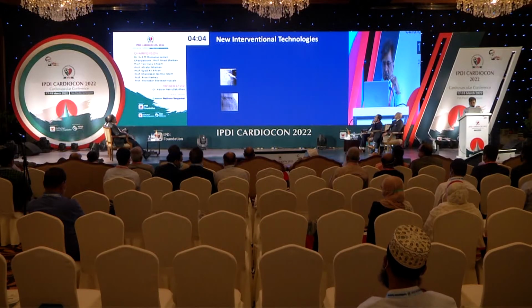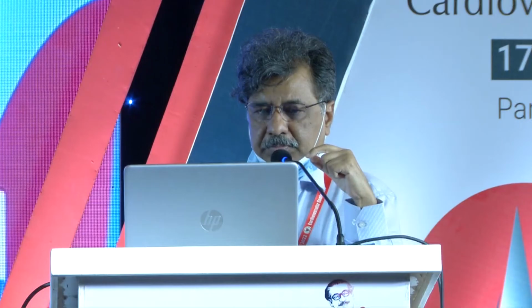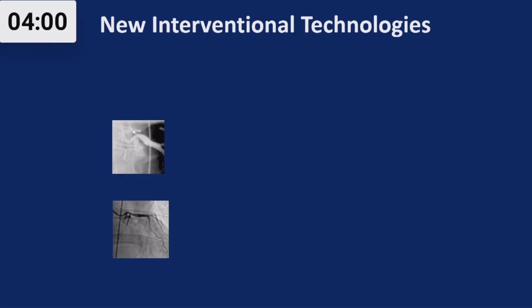And so that's why everyone says that IVUS is essential for left main PCI. I will show you one case report presented by Gary Mintz. This case was done as CABG based on the angiogram, which seemed to show a tight ostial left main disease.